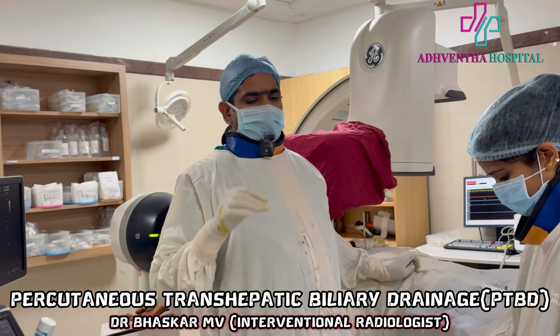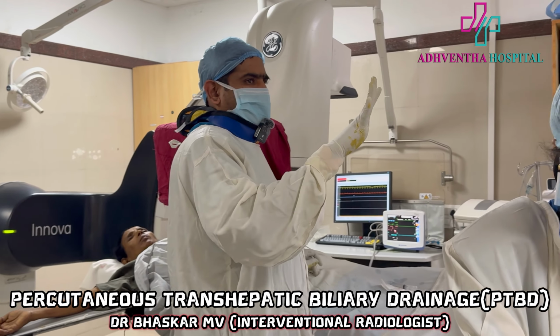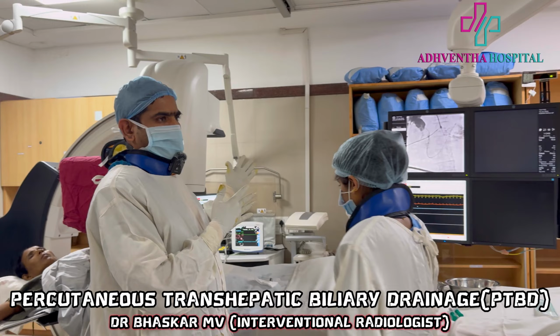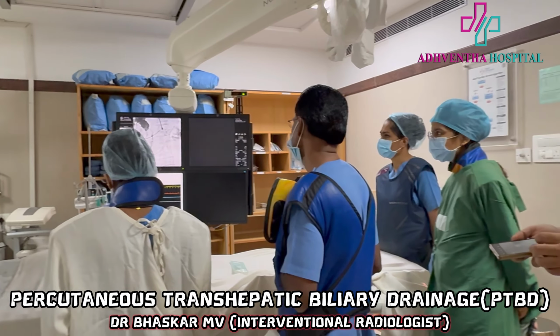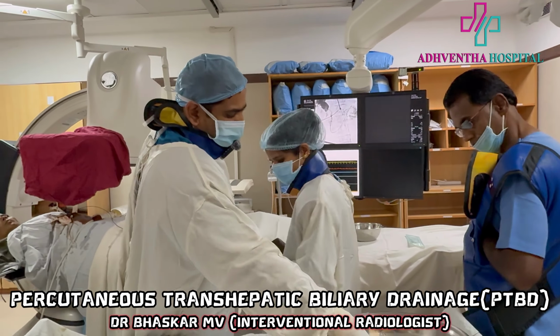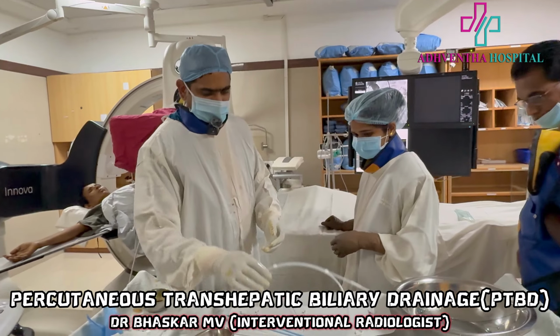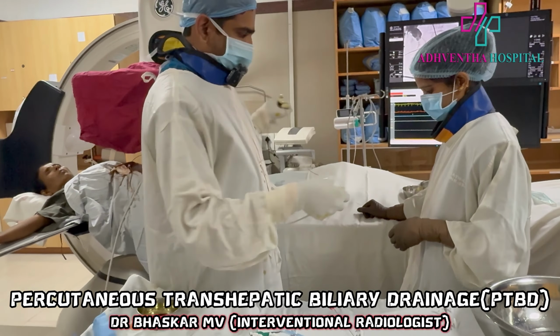Now the aim is to place our catheter beyond the bridge across the dilated biliary radicals and the duodenum, so that this will keep draining. It has multiple holes, so not an issue. Now we need a catheter which is long enough.